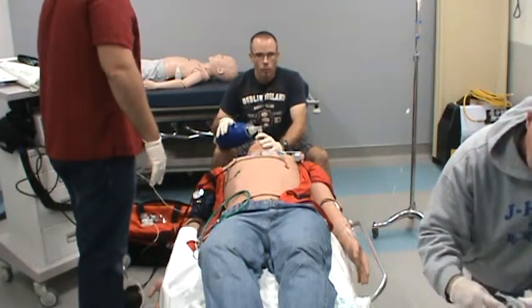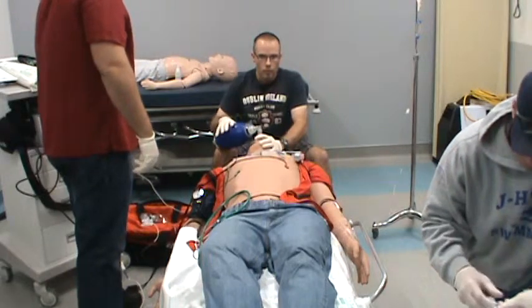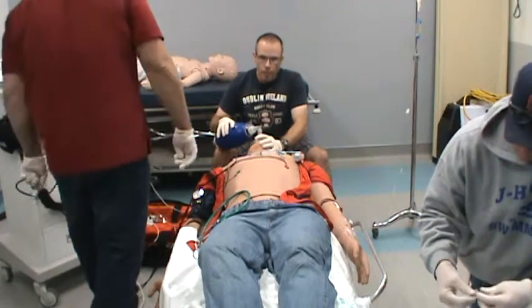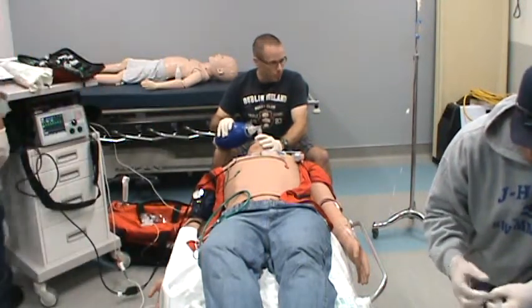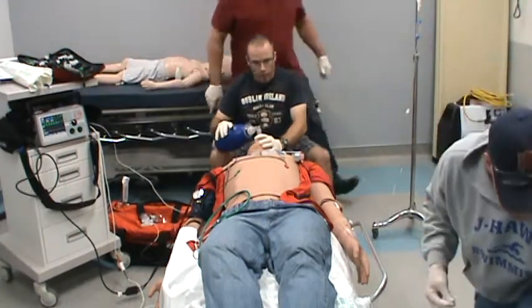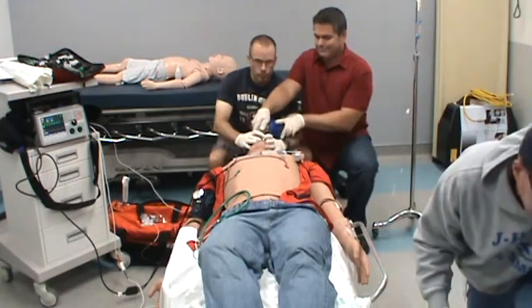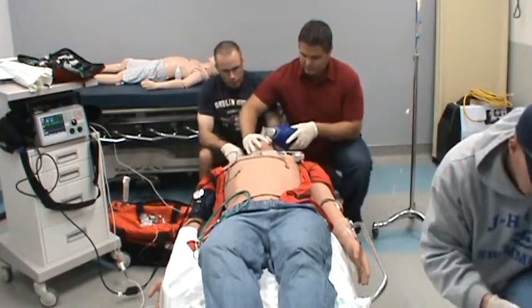Take over so you can finish. Yeah, let me just check the compliance of the patient's lungs here. So far he's bagged fairly easy, alright? So we can ventilate the patient using a bag valve mask, so that's good. Alright. Alright, you got that stuff?